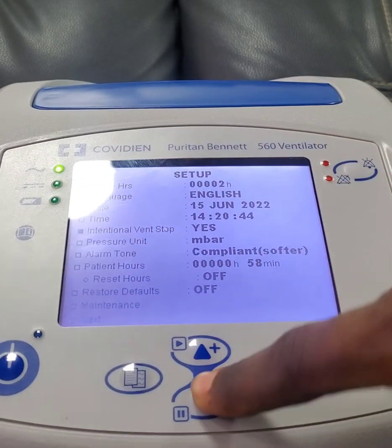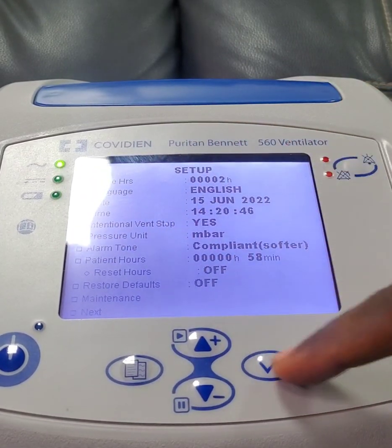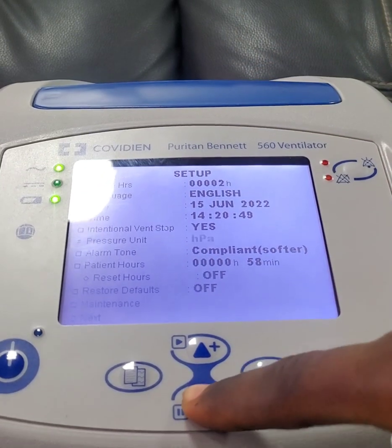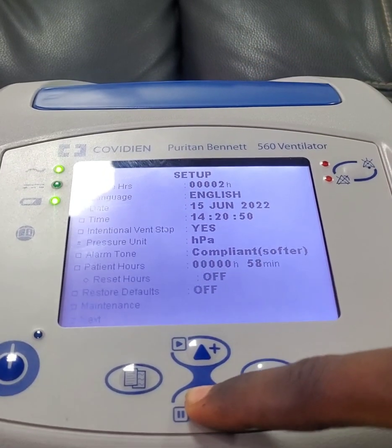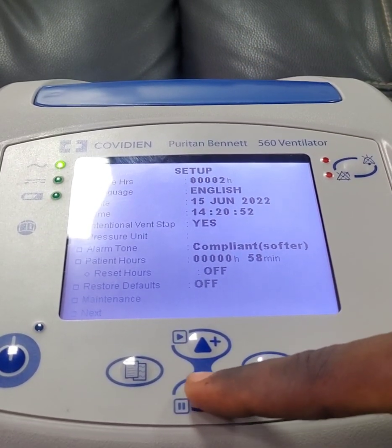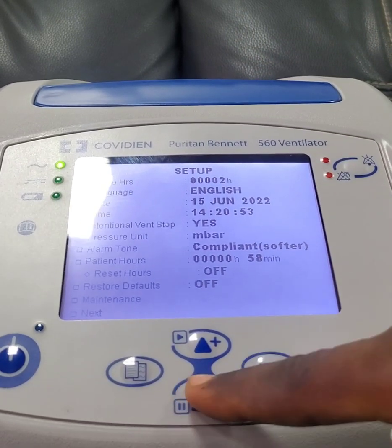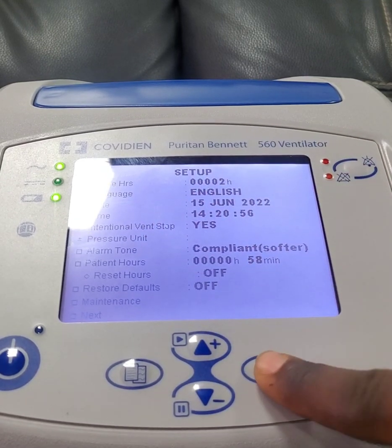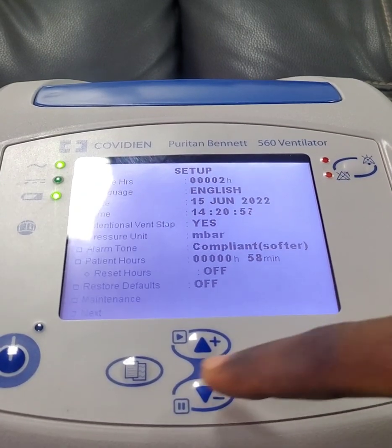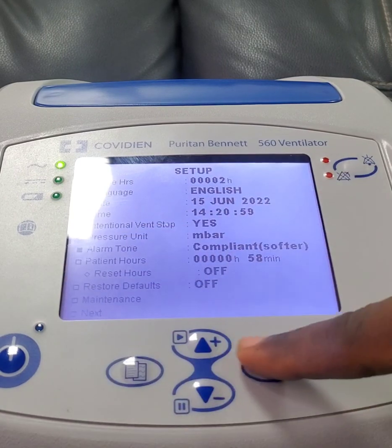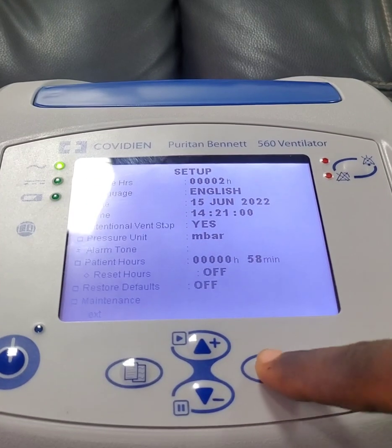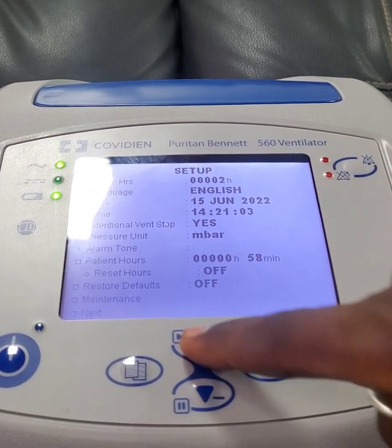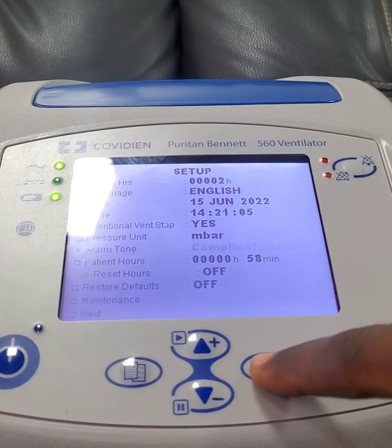Then this is the pressure unit. You can decide to change the pressure unit from mbar to cmH₂O. Let's leave it at mbar. You can also change the alarm tone — whichever one you like.